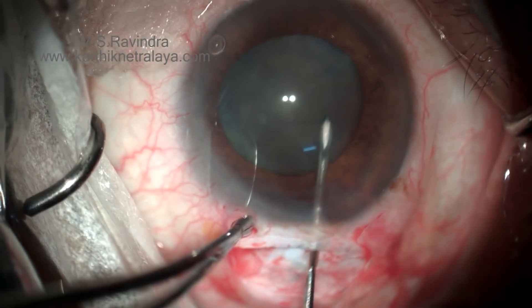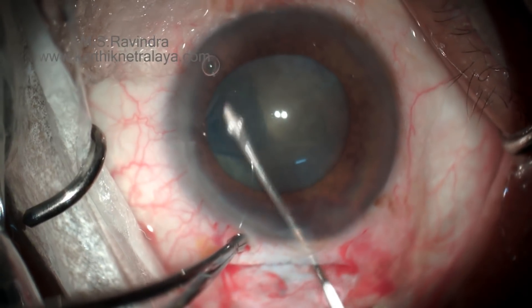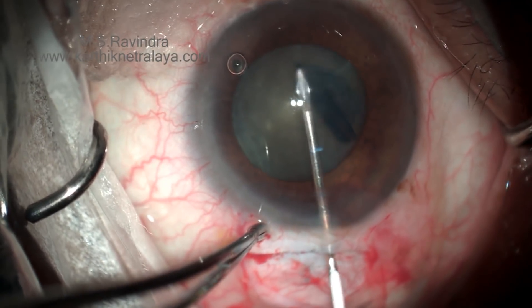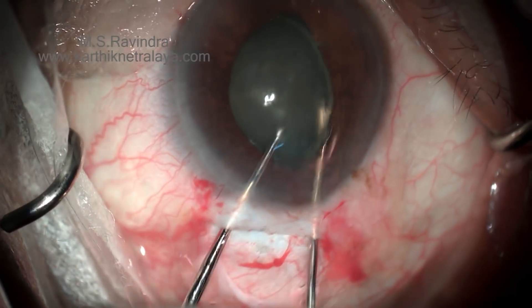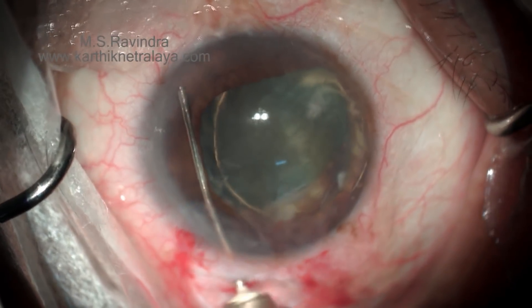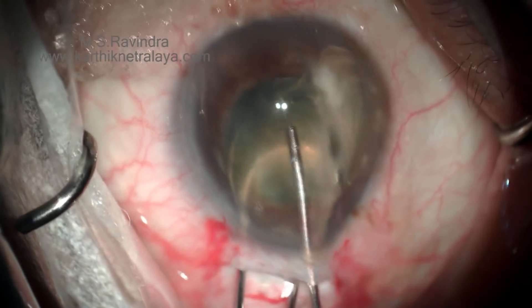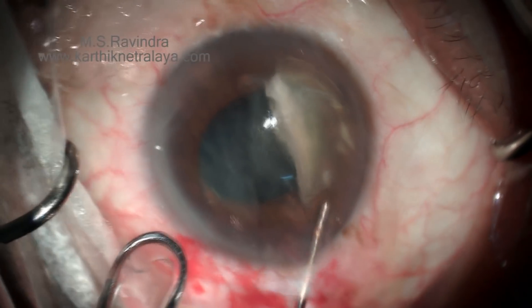In another case, the anterior capsule is stained with trypan blue, and a tunnel floor entry is made. In mature cataract, it is always ideal to do a rhexis as large as possible. The pupil was initially extremely small, but with a small cotton wick soaked with tropicamide plus eye drops placed in the upper left corner of the field, within a couple of minutes the pupil dilates to tolerable levels. Adrenaline, when used intracamerally, will damage the endothelium, so I try my best not to use it in any small-pupil situation.